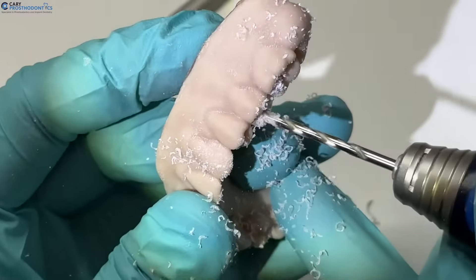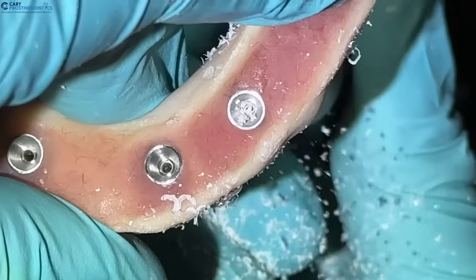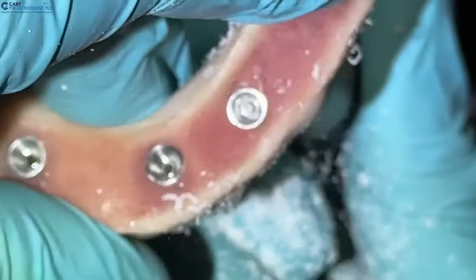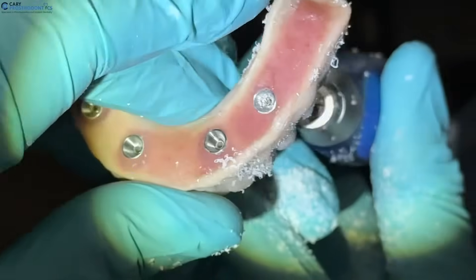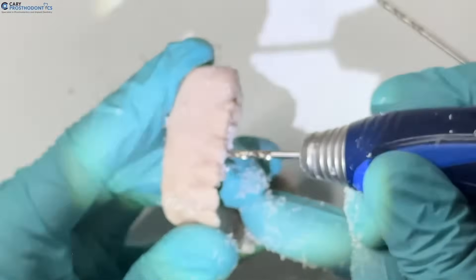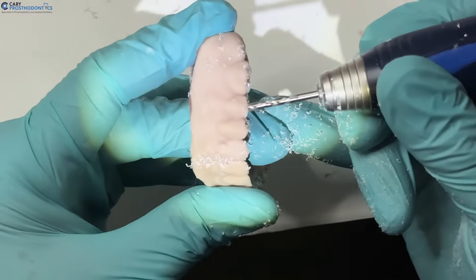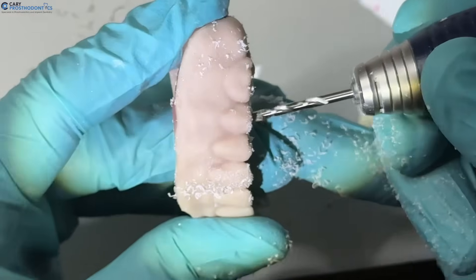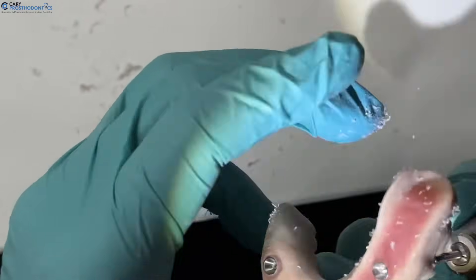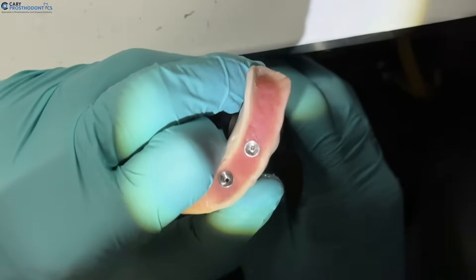Follow the path going in, and you can see from the top that the drill is starting to peek through. Once you get through, pump it a couple of times to make sure the top of that drill is fully coming through.